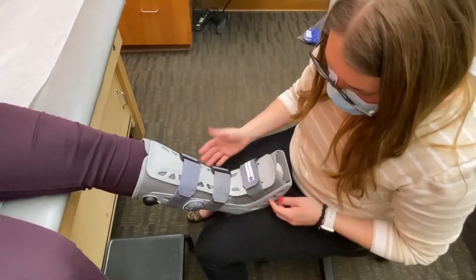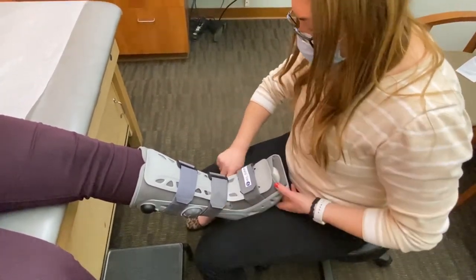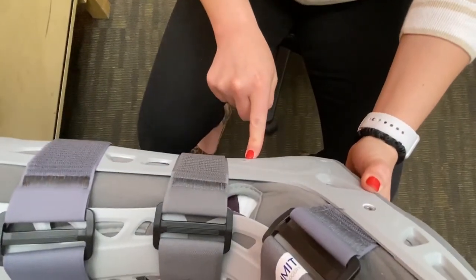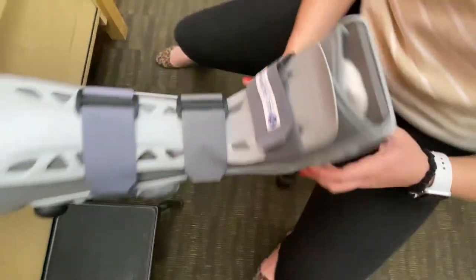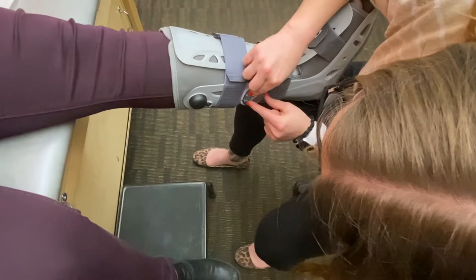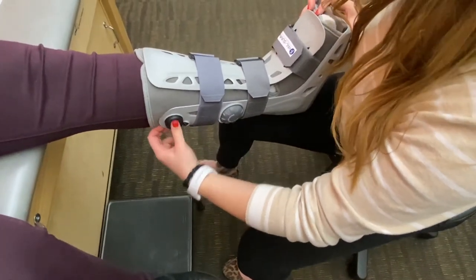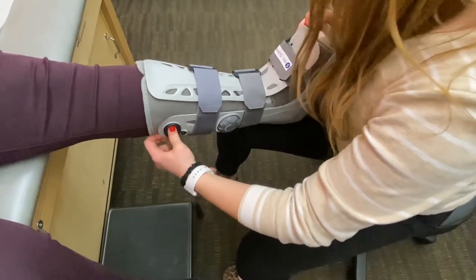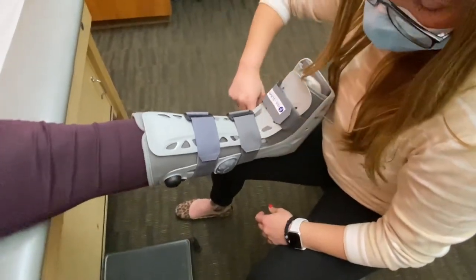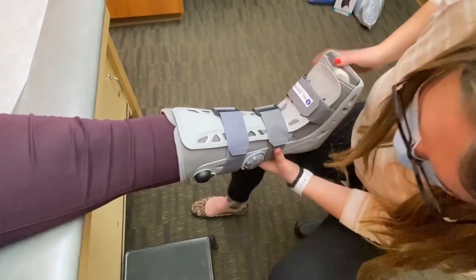Once everything is secure, you can always reassess. Abby has a little bit of space left over on the outside of her boot. You'll notice it's associated with sticker two, so make sure the dial comes in and the two is sitting in the groove. Add a few pumps of air to fill that space. When you're happy, lock everything in place with the safety lock.